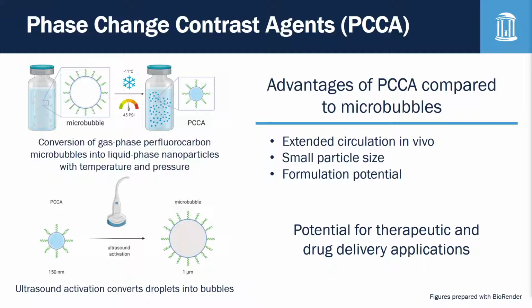As with conventional microbubbles, there are many potential therapeutic applications for phase change contrast agents. Due to their small size and increased circulation lifetime, phase change contrast agents may have therapeutic uses beyond what can be achieved with conventional microbubbles.